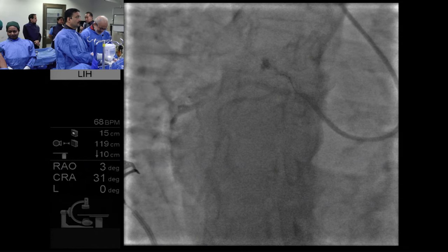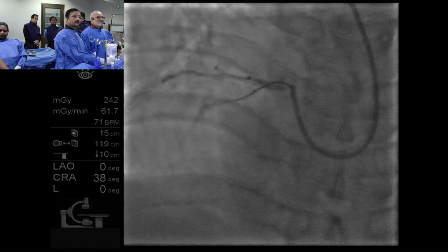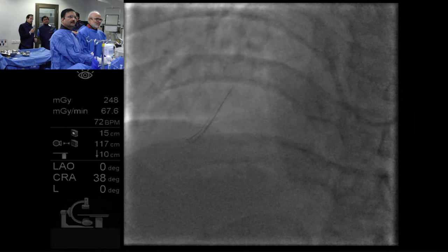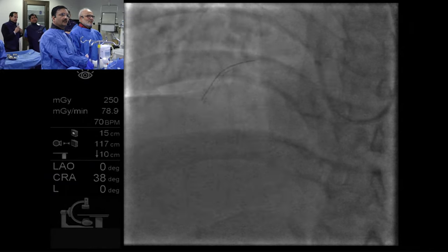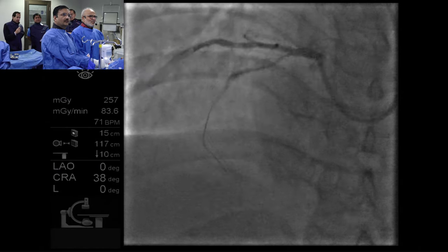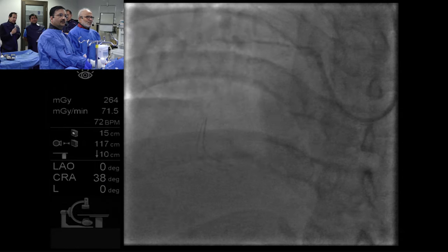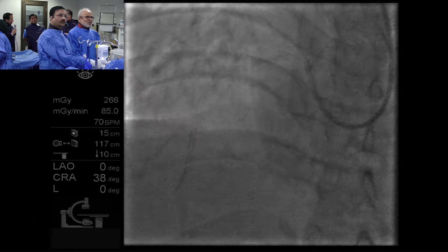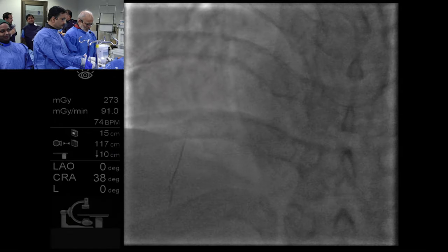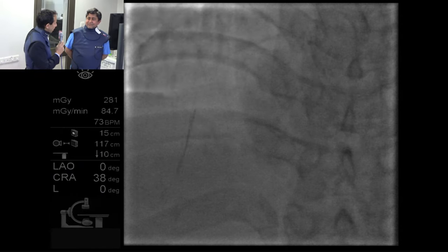Raji, how often are you using a Twin-Pass catheter in this case? Which catheter? Twin-Pass. Twin-Pass, never. I have no experience actually. Yeah, very rarely for this anatomy. It is great for some CTO or some very backward angulated vessels. Sometimes we can use an Export catheter instead of a Twin-Pass in a big vessel. Or now with the angled microcatheters like Supercross, Venture, we don't typically use it for angulation. How about you use the micro Twin-Pass or an angulated microcatheter, very sharp?